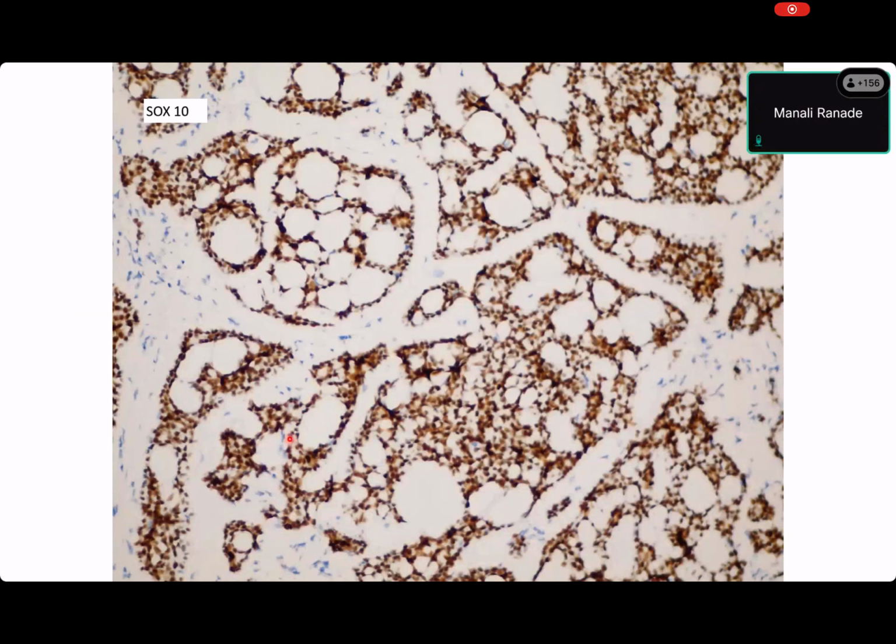Deepa Rani. Deepa, now you just look at this. This is exactly what I was saying. Every single cell in the cribriform areas is expressing SOX10. So there is no luminal differentiation seen here at all, because it's the myoepithelial cells that are proliferating in these groups. I hope you got the message.